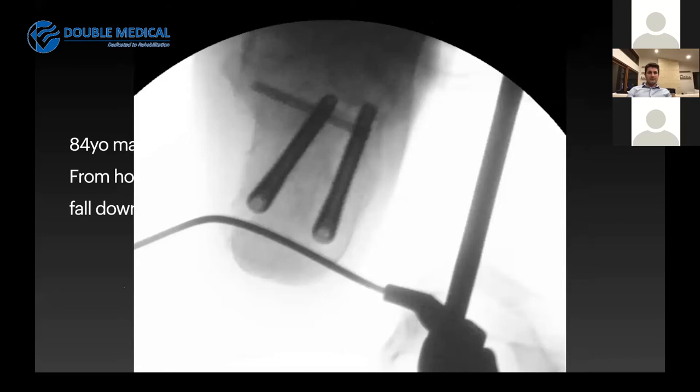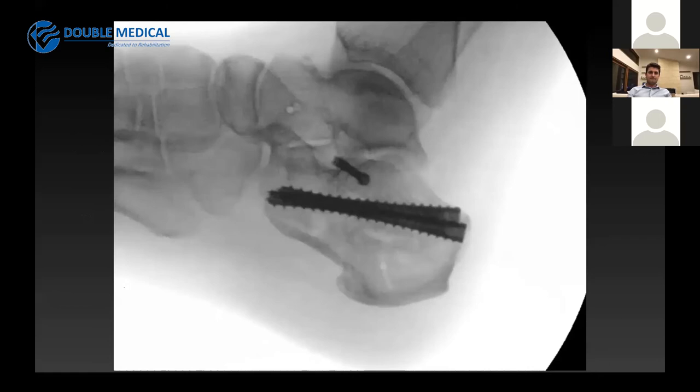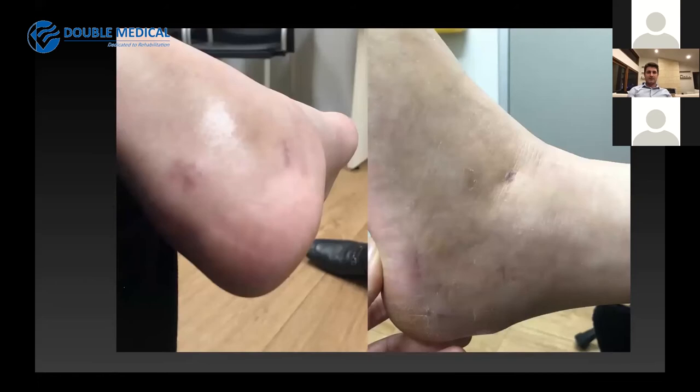This is what the fixation looks like. Following this, I close the wounds with non-dissolving nylon sutures. I place patients in a back slab for two weeks, then review the wounds at two weeks and place them in a CAM boot, non-weight bearing until the six-week mark, with X-rays to confirm radiographic union before allowing weight bearing. This is an example of what the incisions look like at the six-week mark. Even in this gentleman who is a type 2 diabetic — a high-risk patient for a calcaneal fracture — because of the very small wound sizes, wound issues are very unlikely.